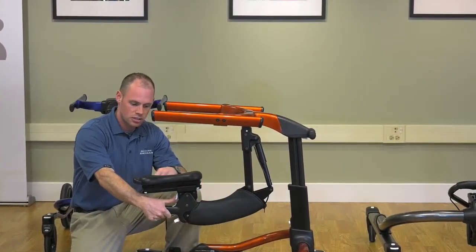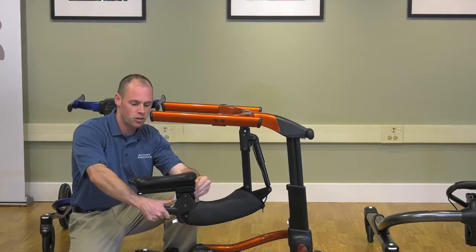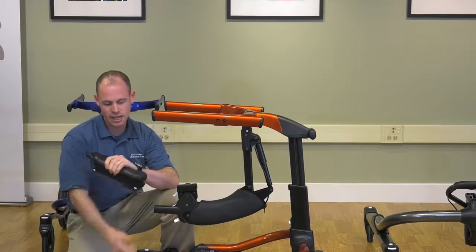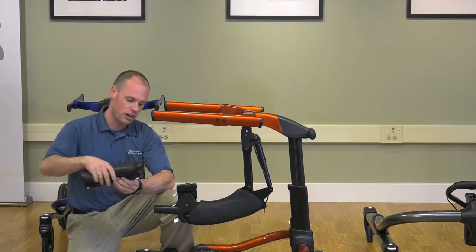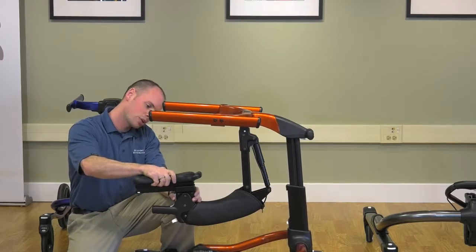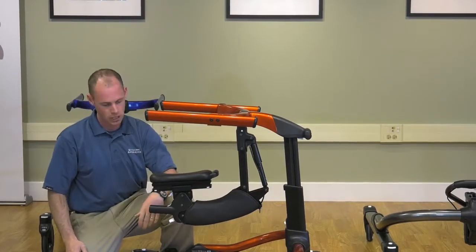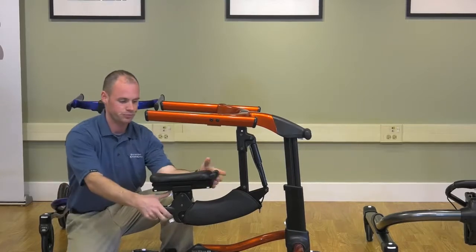Push down the forward backward slide, pinch the tabs at the front, and push the seat out. Turn it around and put it back in the same way, and you have them supported from behind with the seat backwards.